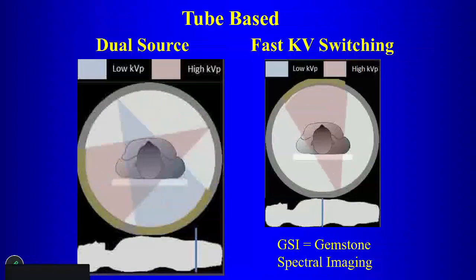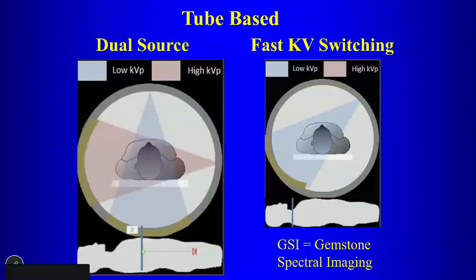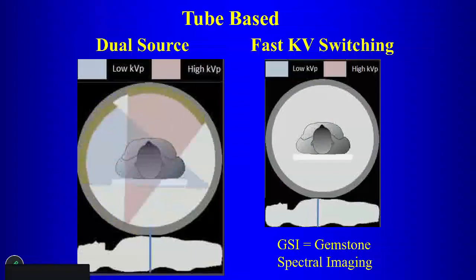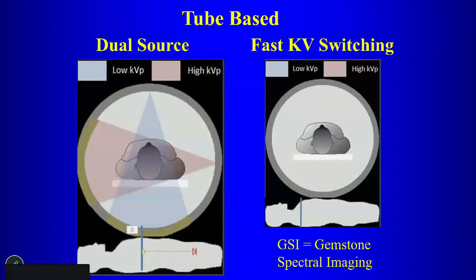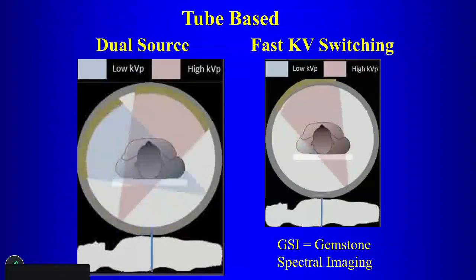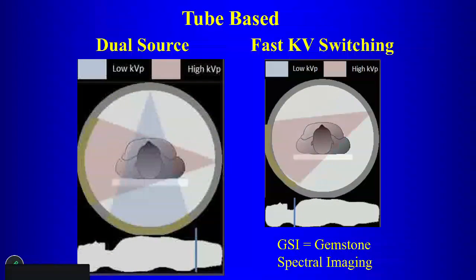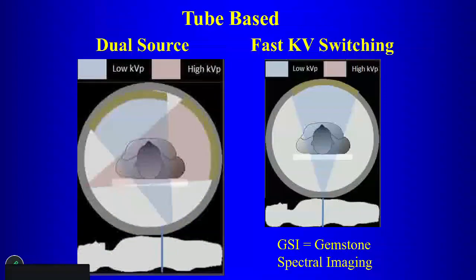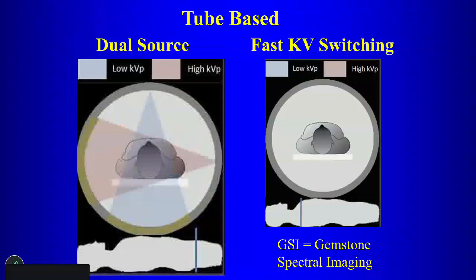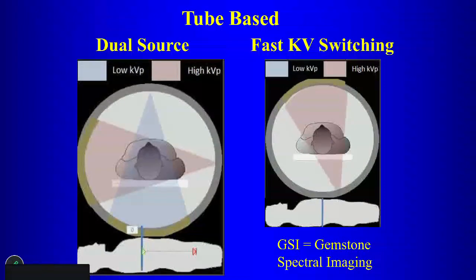Okay. If you want to, let's say, what protocol might you be doing where you really need really accurate information between different energies, where you would want to set the energies different on your dual source alpha, photon counting scanner? What kind of protocol might that be? Where it's very important to get that different spectral information. Not in chest imaging.